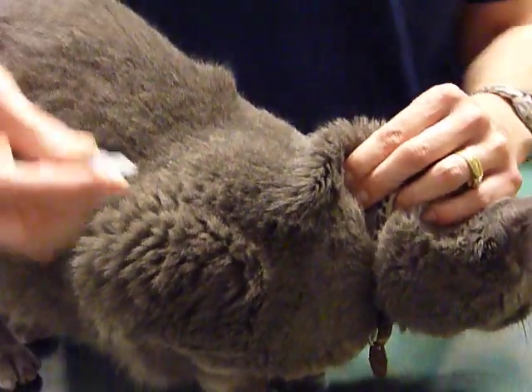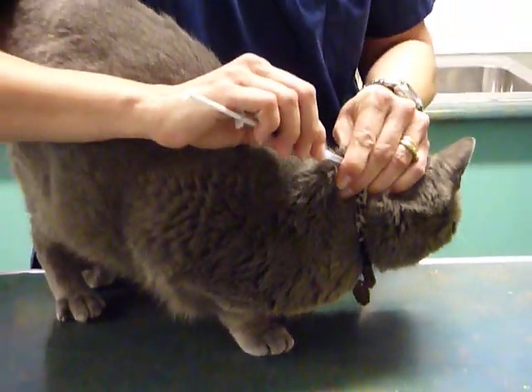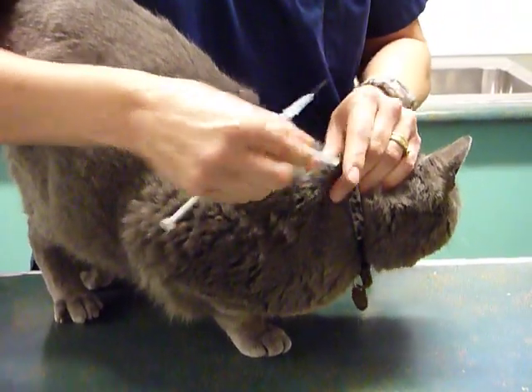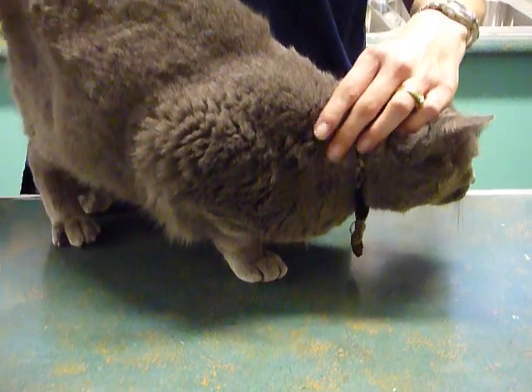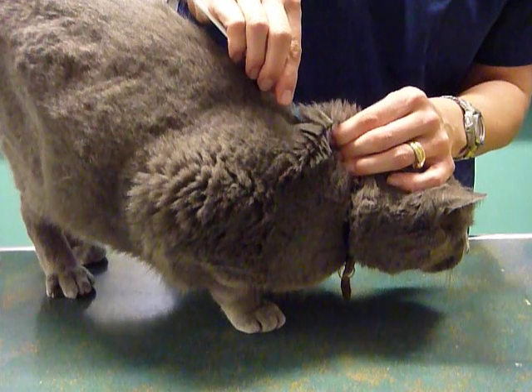Then you have your needle and your syringe. Place the cat on the table, scruff, and place the needle into the base of the tent that you've scruffed.